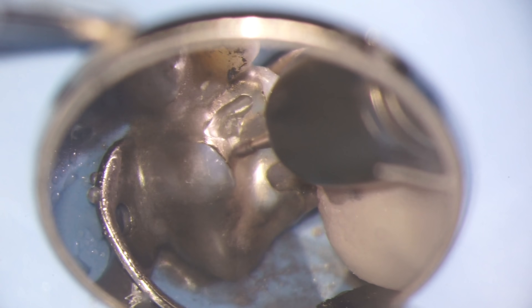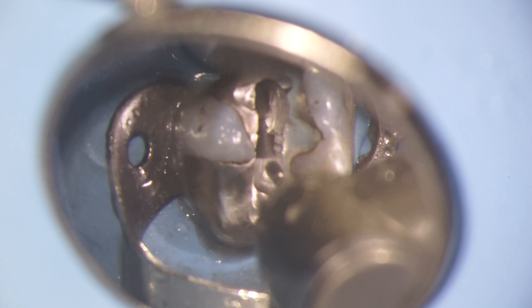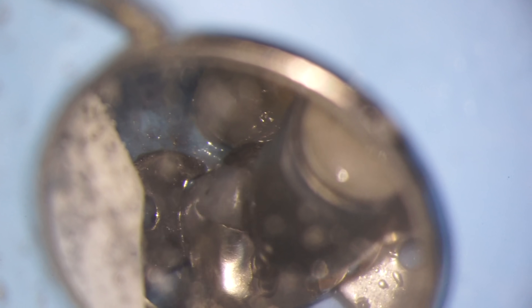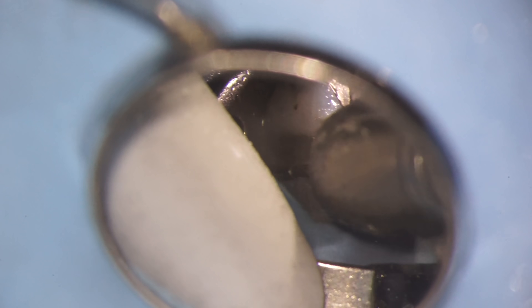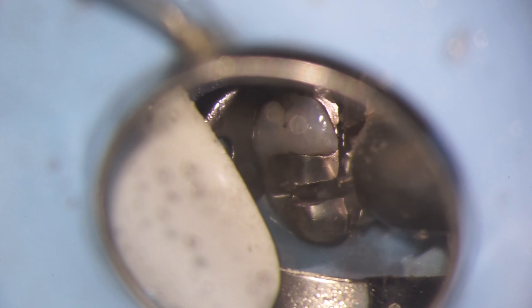The thing you need to understand about silver fillings is that they're actually mechanically locked in place. So I could go ahead and just try and drill it all out, but it actually makes a little bit more sense to split it into multiple pieces so that each separate piece is no longer locked in place. As you'll see, once I complete a couple splits here of the filling, the first piece will just dislodge naturally.